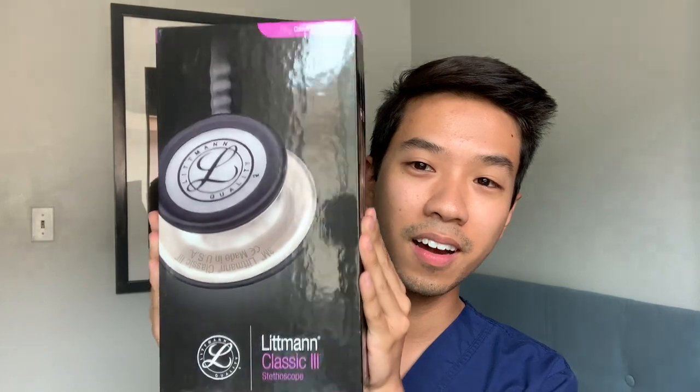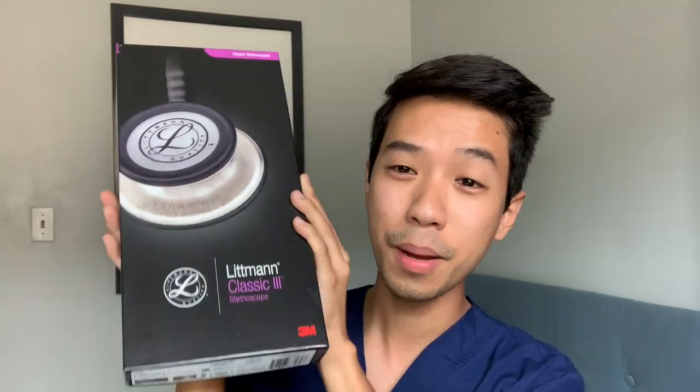I actually have my stethoscope right here. I'm emotional because when I was younger I'd see medical professionals — doctors, nurses, PAs — with stethoscopes around their necks and I thought they were so cool. I never thought I could be in their footsteps one day, and now today I get to open my own. Here we go — this is the packaging, the Littmann Classic 3 stethoscope by 3M.